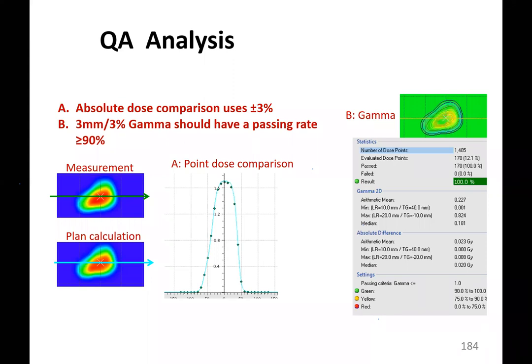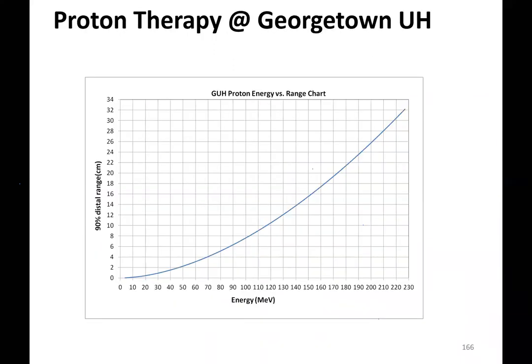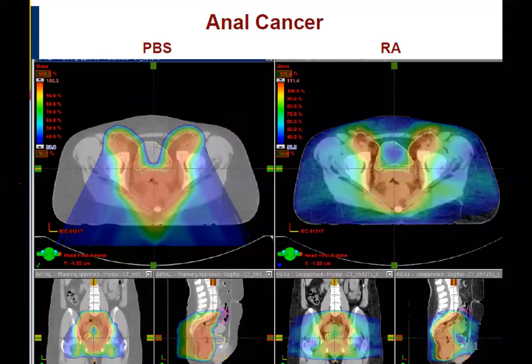Dr. Rashid, he's not Dr. Abar. Okay, it's a different person. Okay, fine. Yeah. So if you compare between the passive and pencil beam scanning, okay, so for a 3D CRT and IMRT, which one would you say is more prone to higher uncertainties in terms of planning?